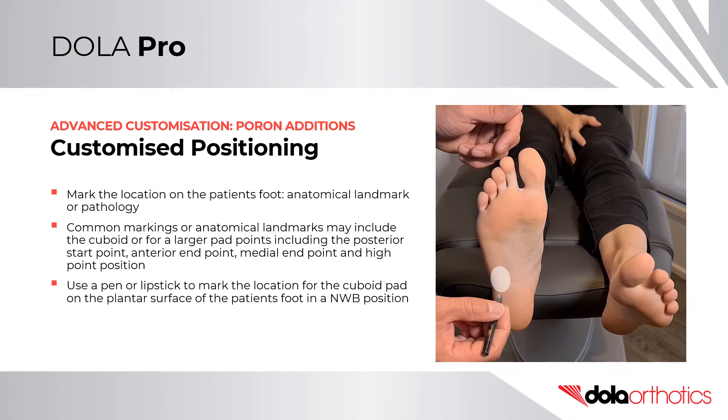Customised Positioning. For a custom position, mark the position required on the patient's foot and transfer to the orthotic. Common markings or anatomical landmarks may include the cuboid, or for larger pads, include a posterior start point, anterior end point, medial end point, and high point position.